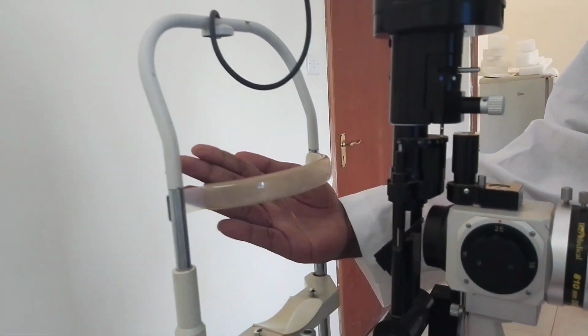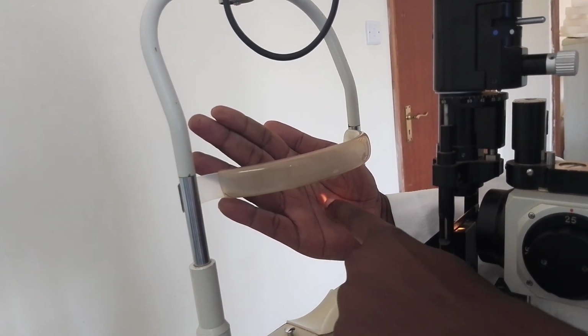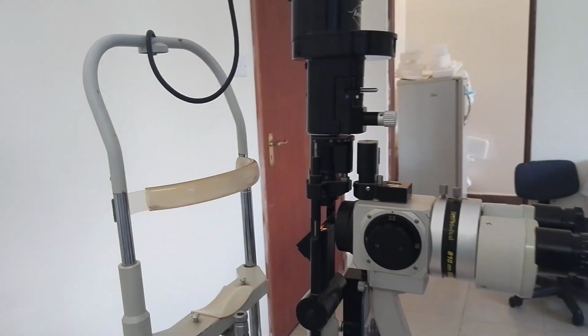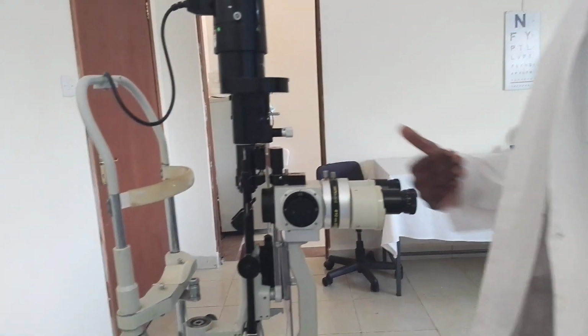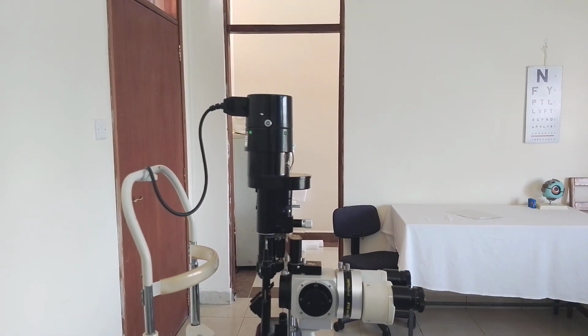That's when you see if it's functioning well, and you can see this one is okay because there's light there. From there, you position the patient this side, the way you have demonstrated. Then the doctor sits on this other side to examine the patient.